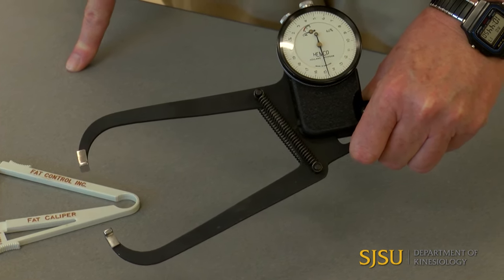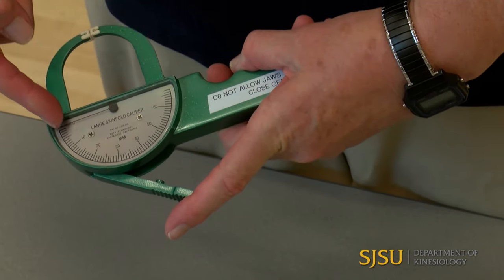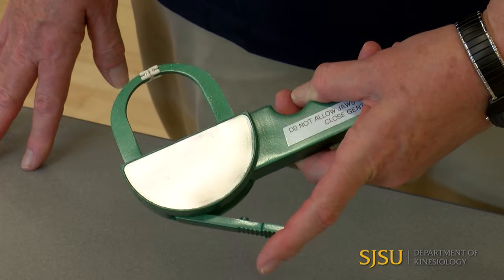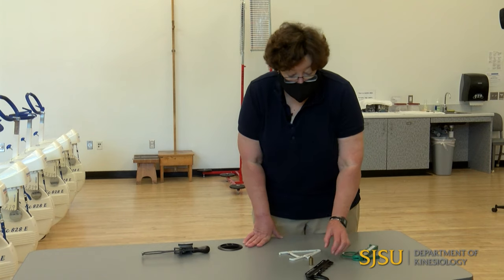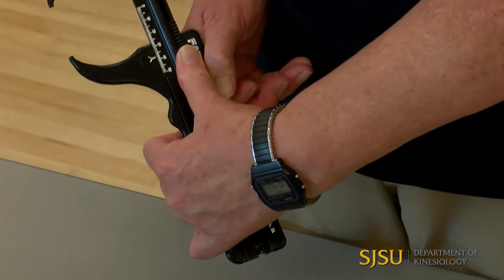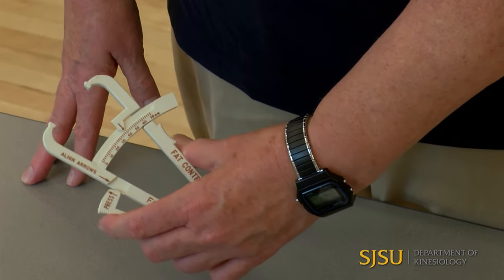The Lang skinfold caliper is the one I'm most used to using. With the Lang, you'll read millimeters right on the dial as the needle moves. The Harpenden and the Lang calipers are around $200. There are less expensive models — there is a Fatometer, which is a little bit difficult to use, and it costs only about ten dollars.